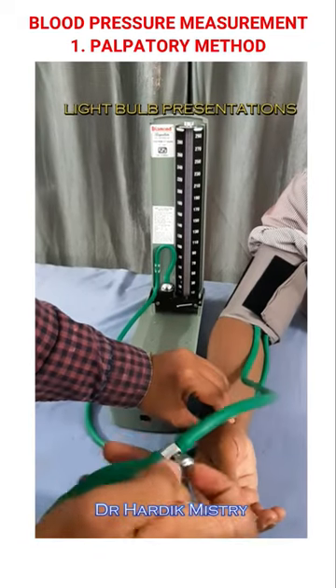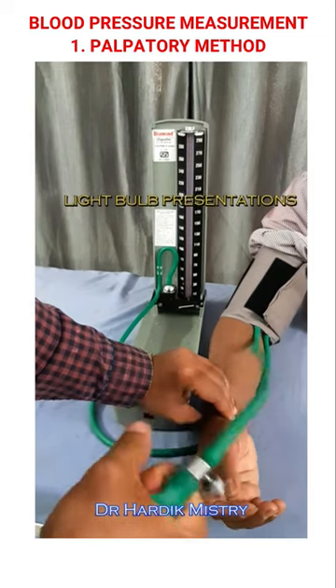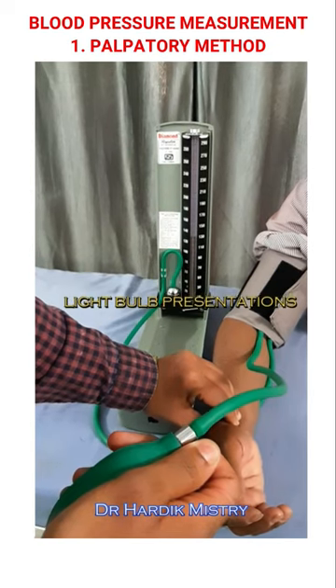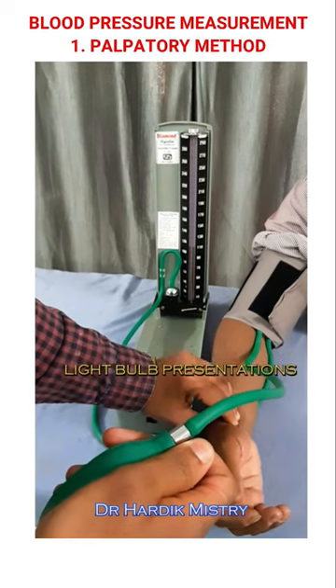Put three fingers over the radial artery and feel the pulse. Close the leak valve screw. Raise pressure in the mercury manometer up to 10 mmHg above the point when the radial pulse disappears. Slowly open the leak valve screw and reduce the pressure. Mark the pressure when you feel the radial pulse — it's the systolic blood pressure.